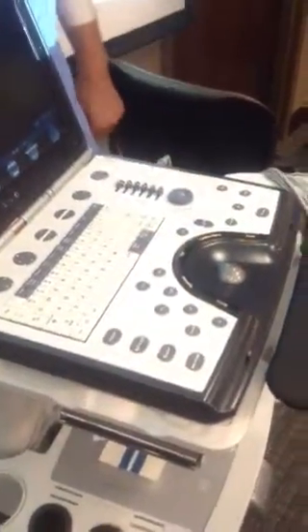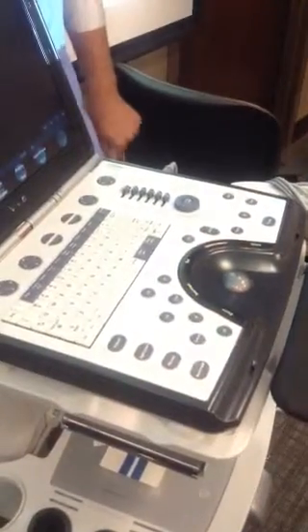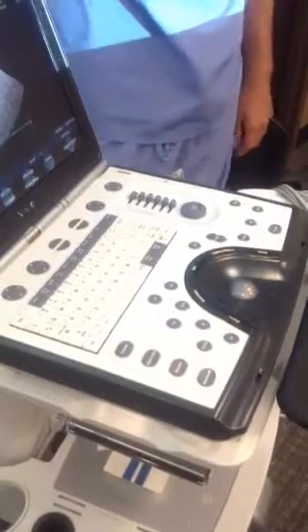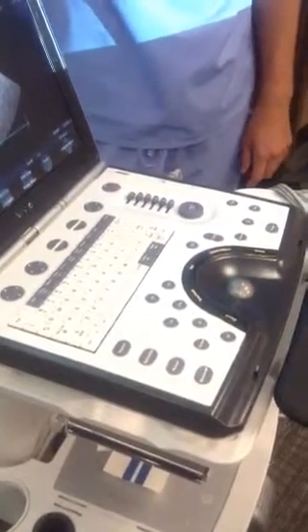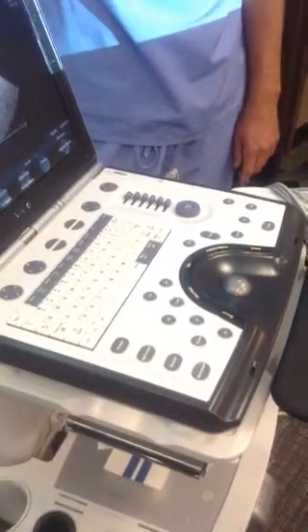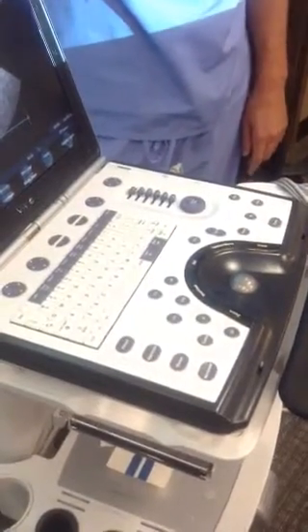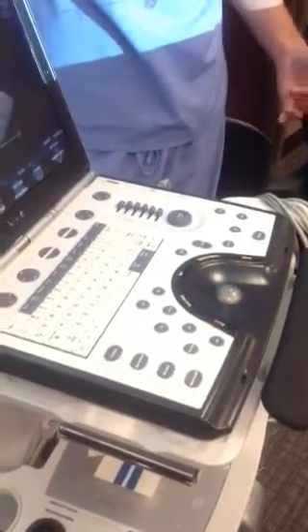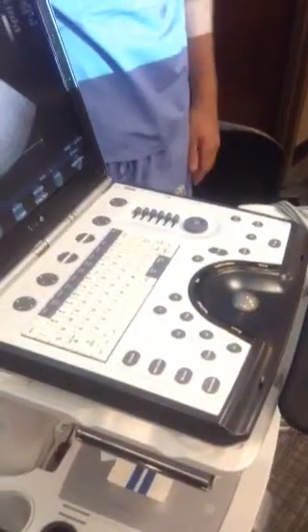So a suggestion also is, even though you can do everything here, you're probably better off just storing everything. When you get to Synapse, you can edit your images, delete things, do everything there. So I usually will just store, and then go there. The more you get here, the better, typically. Because you can always take images away. You can't add images after, so you're always better off editing.